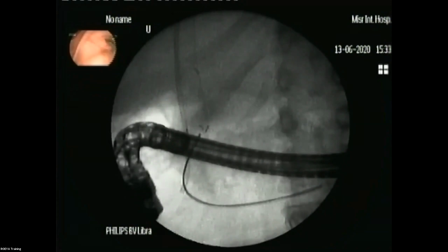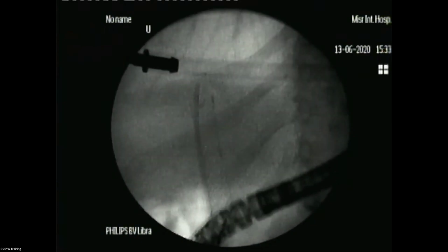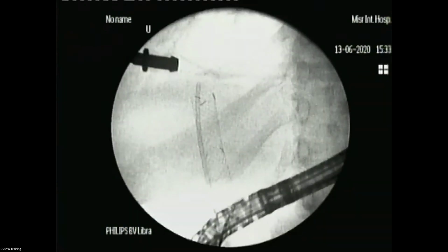So in this patient, what I did was the following. Because she had a benign stricture occupying the common hepatic duct, very close to the bifurcation, I put a specific fully covered metallic stent called the CAFE stent. This stent is very short, 4 to 6 centimeters, and lies completely inside the duct. As you can see on the fluoroscopic image, I dilated the stricture and put it inside. But one part of it entered the right duct, blocking the other part. So when I do this, I simultaneously put a 7 French stent into the left duct to make sure the metallic stent didn't block both sides.